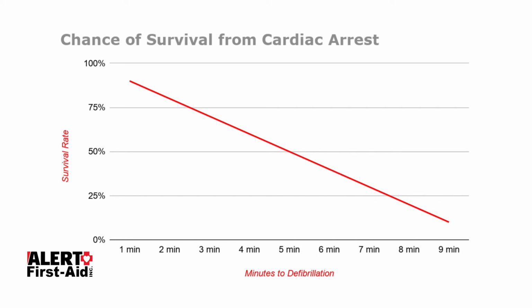For every minute that passes, the odds of resuscitation go down by another 7 to 10%. The combination of good CPR and applying an AED quickly is the key to resuscitating any person who's suffered a cardiac arrest outside a hospital.